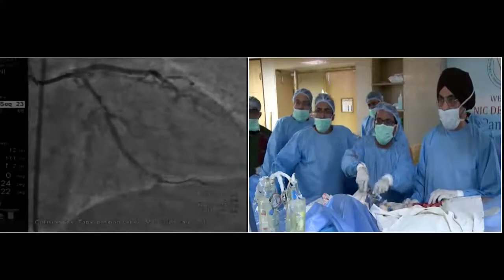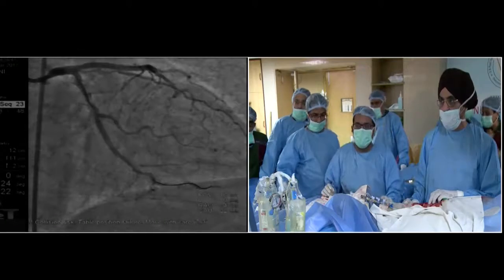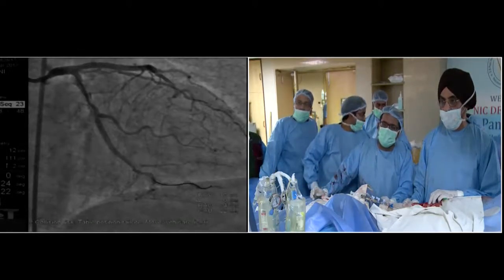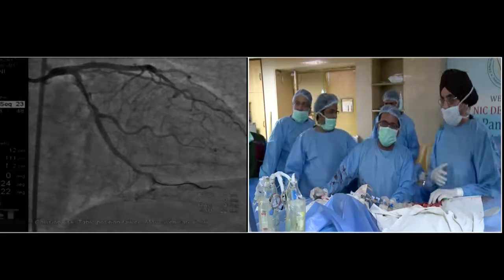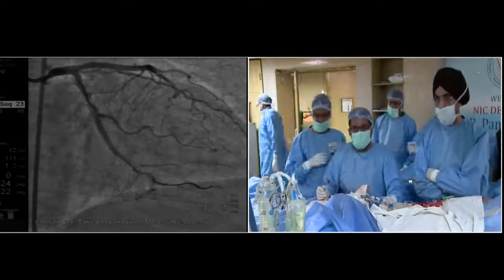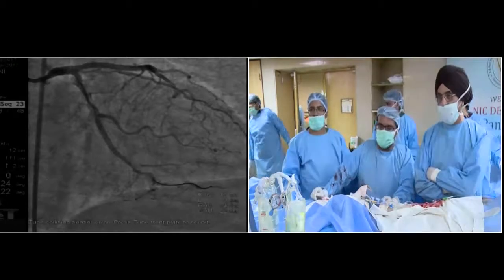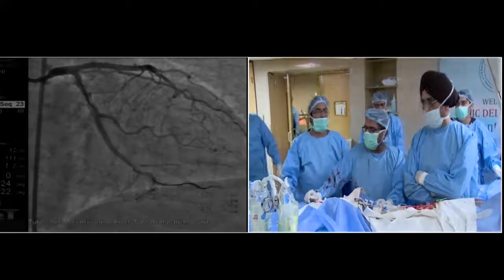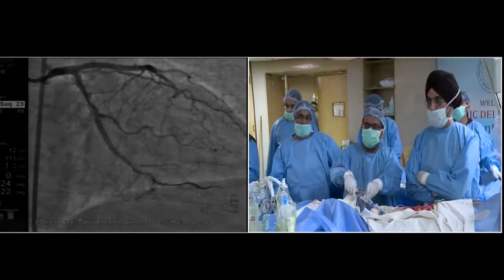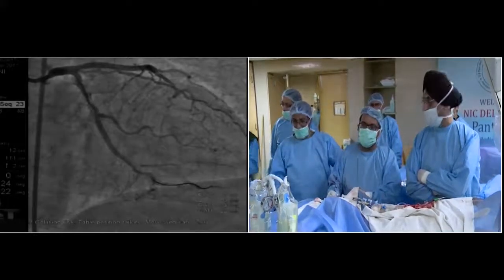So I may use a longer stent for the proximal part. We see just post-ostial, there's a small dissection, and I'll use a 22, 2.75 by 22. I used the 2.5 by 18 for the distal part, and for the proximal part, I'm taking a 2.75 by 22. I will start at the post-ostial region and go up to that OM.